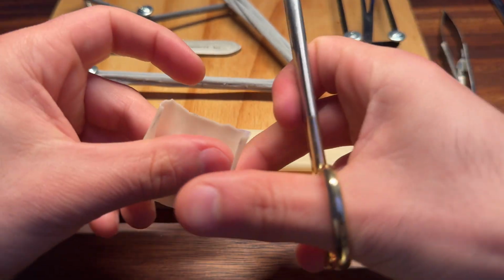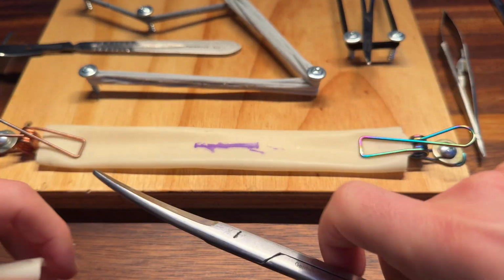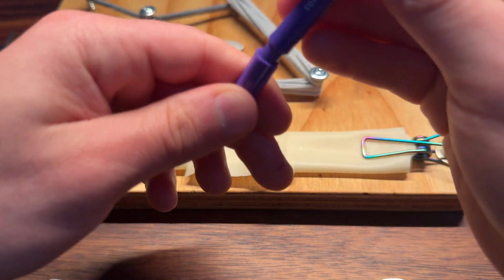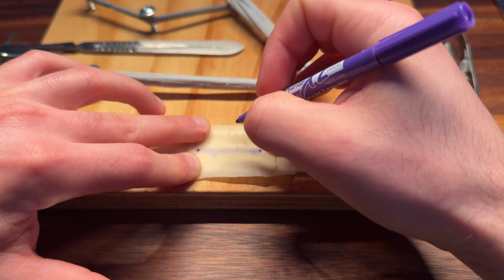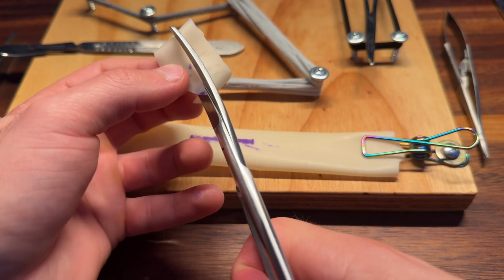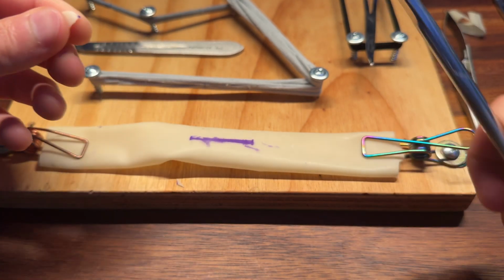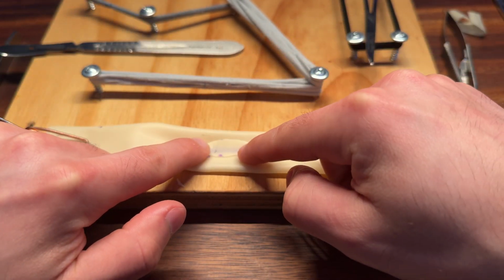Alright, so let's pretend like we harvested a vein from somewhere else, right? So you have this piece of tissue that you basically want to make into a sort of lemon shape, something like that, that's going to fit in the length of this 3 centimeters. Alright, so here's my patch, and that's going to sit on top like so, okay?